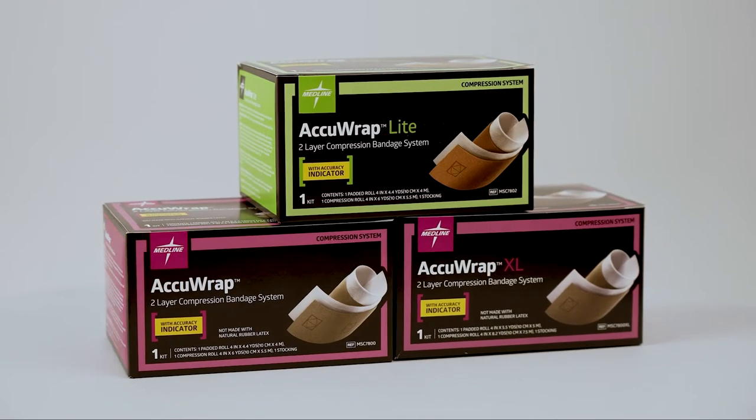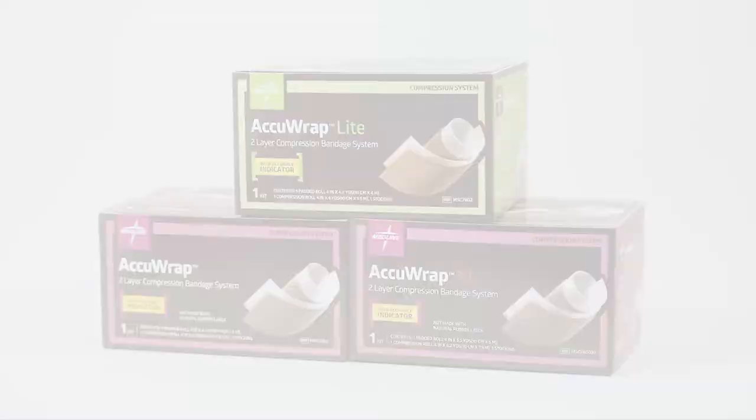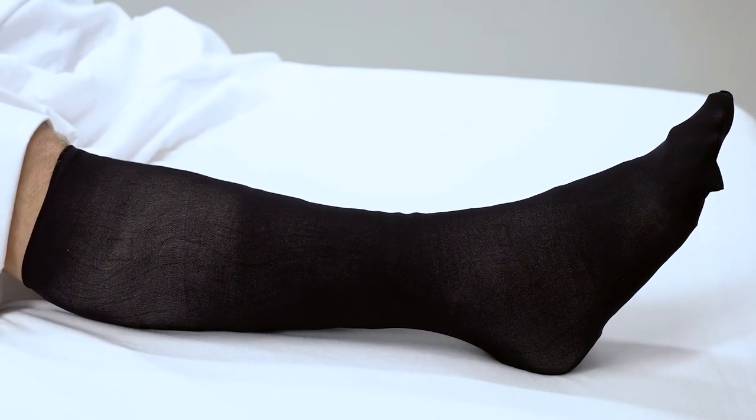ACCURAP is also available in a light and XL version. ACCURAP's low-profile design and included stocking help enhance patient comfort and compliance.